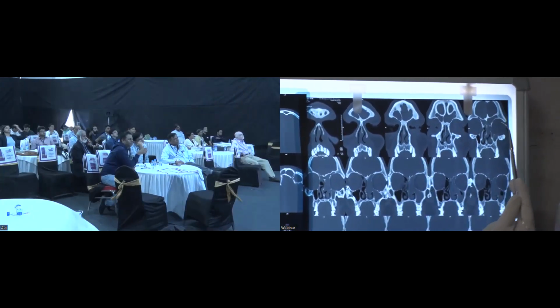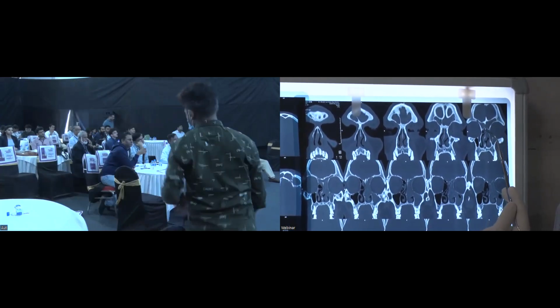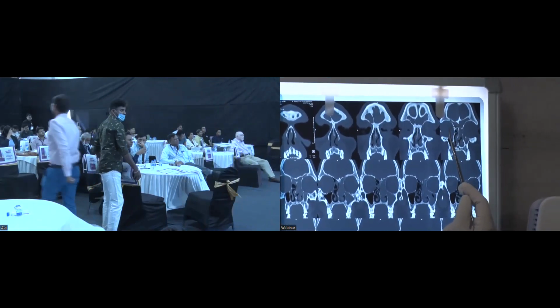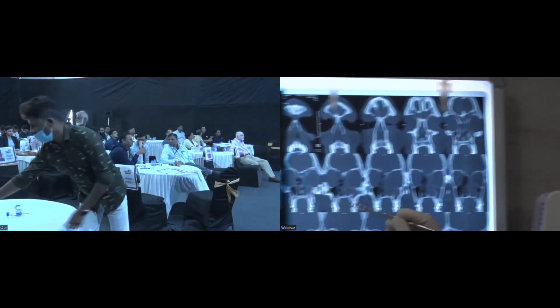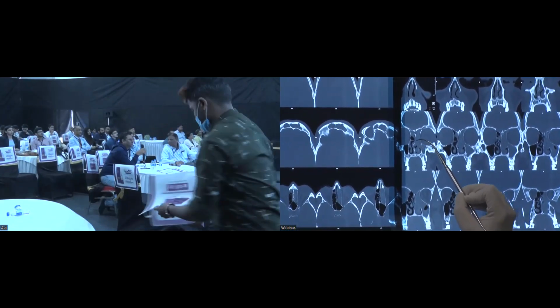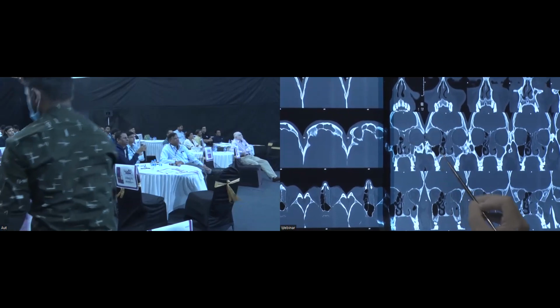If you see that the entire osteomeatal complex and the area of frontal sinus is involved. In fact, you can see that there is a communication between the two frontals when you go a little backwards. Here you can see that the uncinate process is almost dissolved, and the maxillary sinuses are involved, almost attenuated.